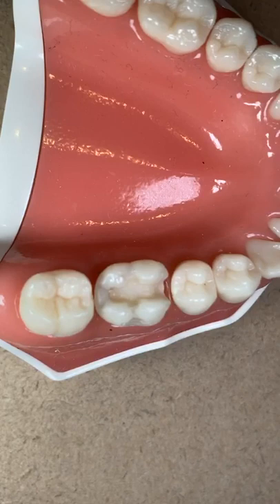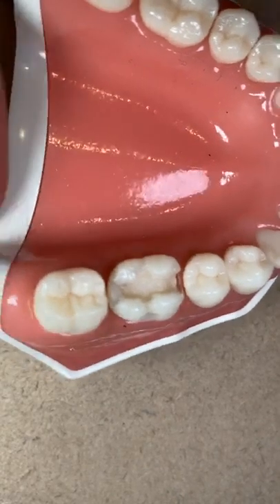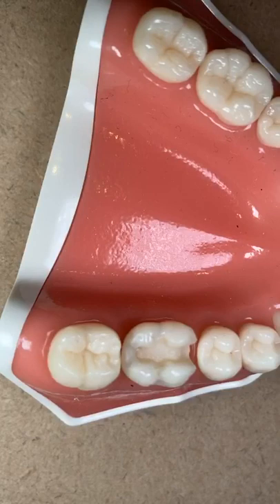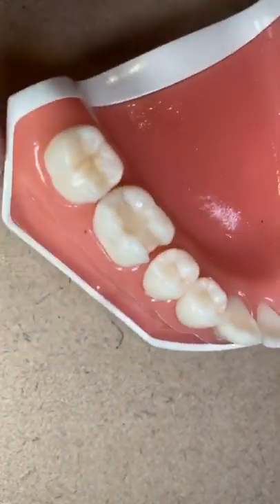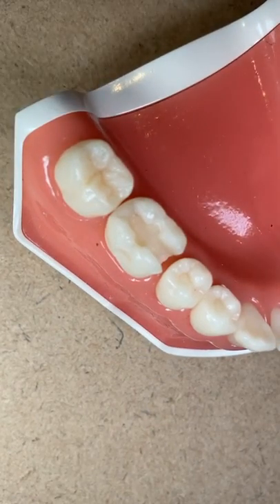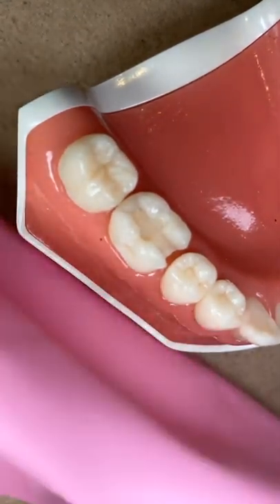So how about we use some rubber dam? Do you want me to do rubber dam? Okay, we put rubber dam first, okay? Or not. Okay, rubber dam, okay? So basically, here's the one that I use, the pink rubber dam.